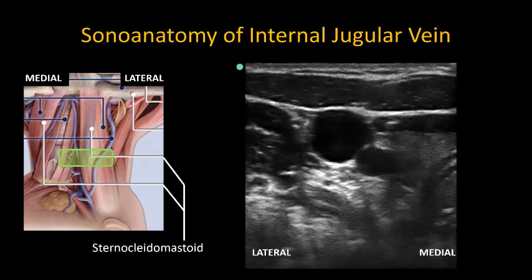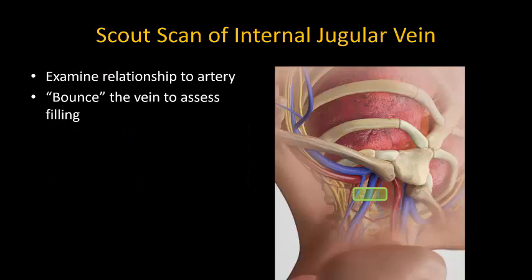The ultrasound probe is placed in a transverse orientation, approximately midway between the clavicle and the mastoid process, over the sternocleidomastoid muscle. The internal jugular vein and common carotid artery lie under this muscle. Other structures that may be seen include the anterior scalene muscle laterally and the thyroid gland and trachea medially.